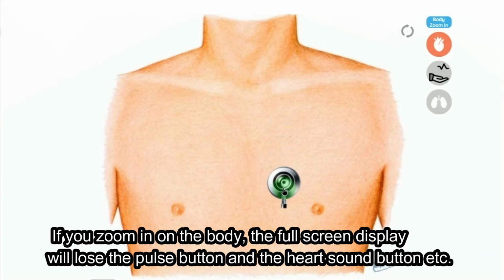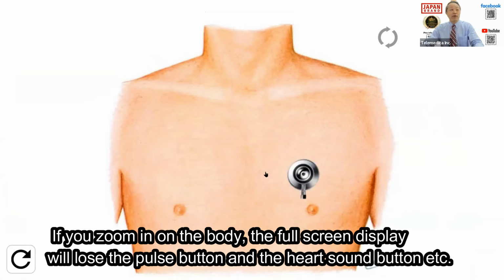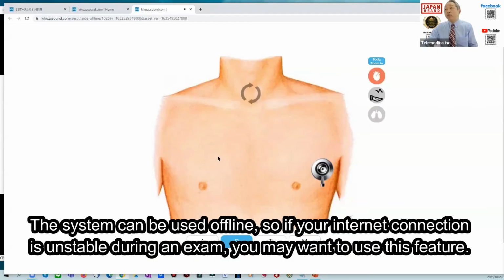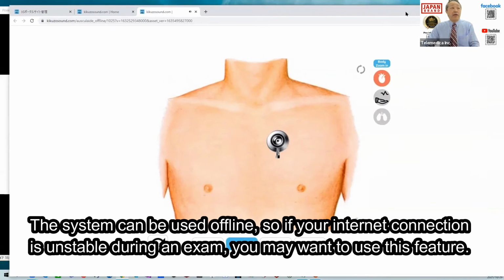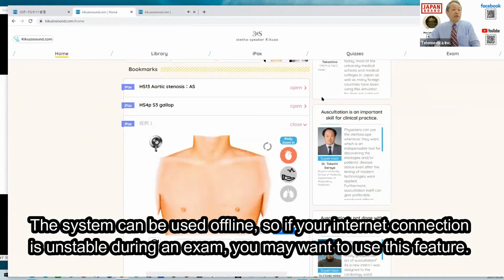If you zoom in on the body, the full screen display will lose the pulse button and the heart sound button. Click the refresh button and listen to the sound from 0 second. The system can be used offline, so if your internet connection is unstable during an exam, you may want to use this feature.